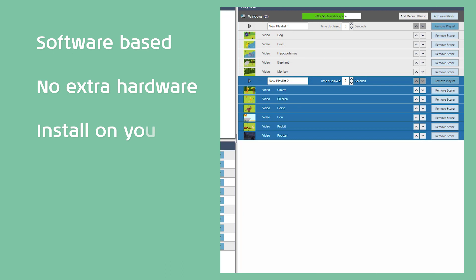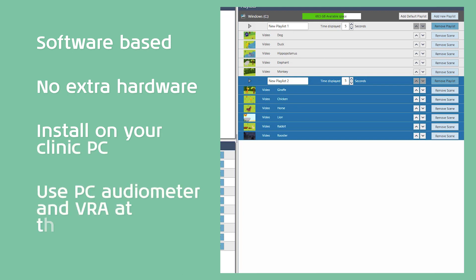You can install the VRA Pure software on your clinic's own PC. This makes it possible for you to operate both the PC audiometer and the VRA Pure at the same time.